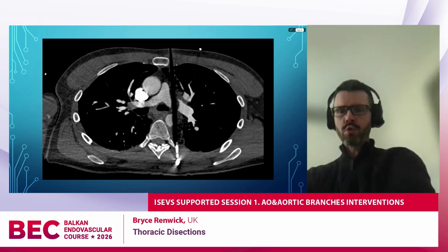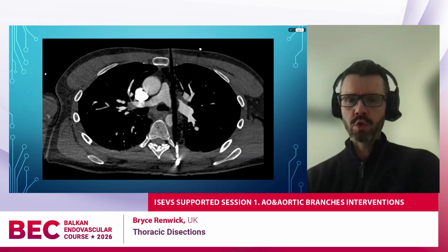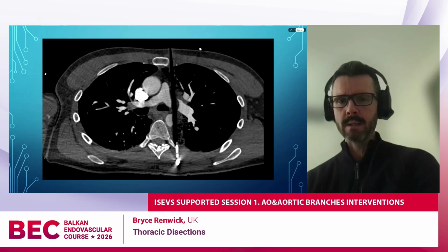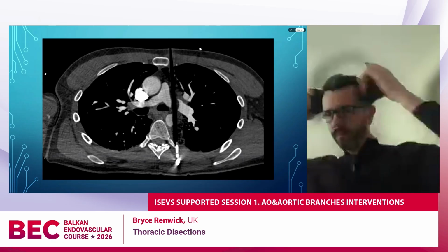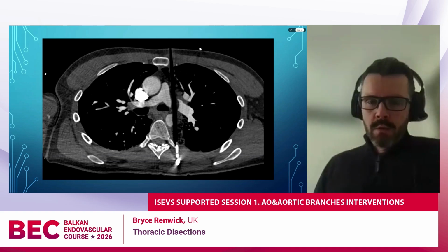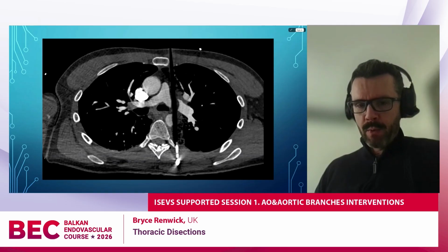This is a sports crossbow, and the carbon on the shaft of a sports crossbow bolt does not show up in CT scan. So you can see there's an X-ray void through the whole mediastinum. That's not empty space. That's definitely a crossbow quarrel. But you can see clearly the flow void from the crossbow and also a steel tip in the paraspinal tissues.